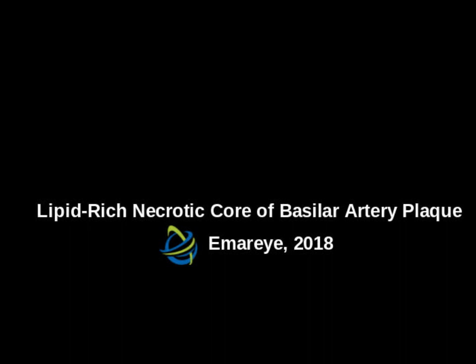As we all know, a layered plaque is considered as a unique finding of the lipid-rich necrotic core on CET1W imaging. In our study, all visualized layered plaques in the basilar artery were associated with thicker wall and higher degree of stenosis.